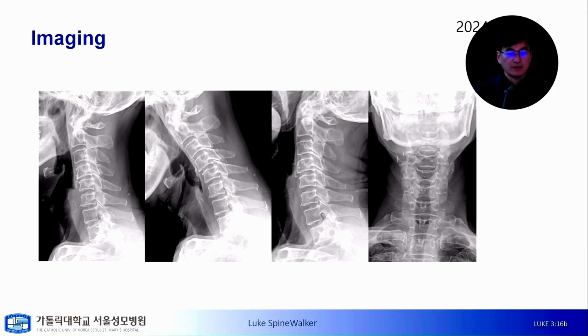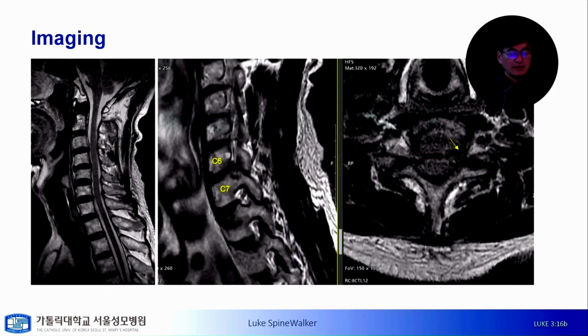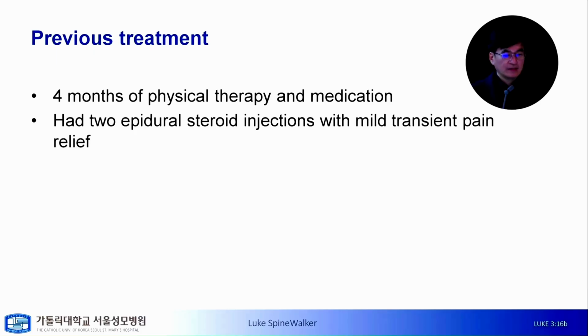The X-ray doesn't show a specific problem. I love to measure the basic parameters. Look at this. No cord compression. Look at the foramen, yes. Between the 6, 7 level, there's a protruded disc and stenosis. The tip of the SAP is pinching the foramen. So I love to evaluate every single patient with CT, especially in the cervical spine. I'm going to define the margin from medial to lateral, how much bone decompression, how much distance from the medial tip of the SAP, right? I measured 6.5 mm from the medial tip of the SAP for proper decompression, right?